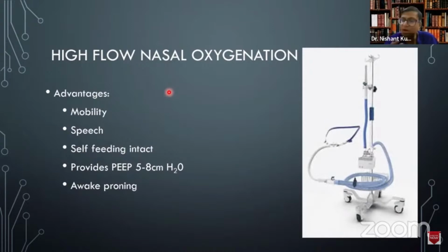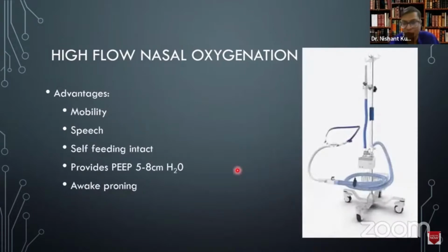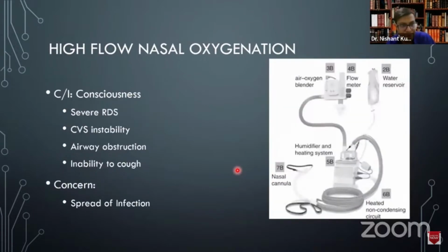Now, with this face mask or the Venturi mask, it is very difficult for the patient to lie prone. So these are the cannulas which fit snugly onto the face, into the nostrils, and the patient can easily prone himself if required.